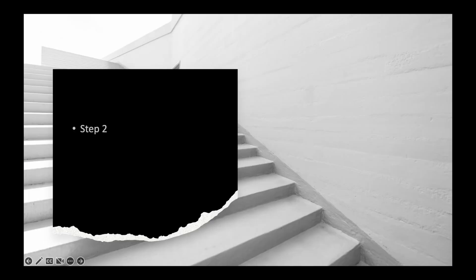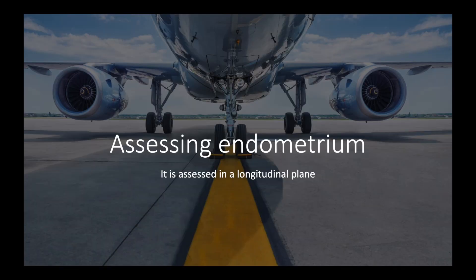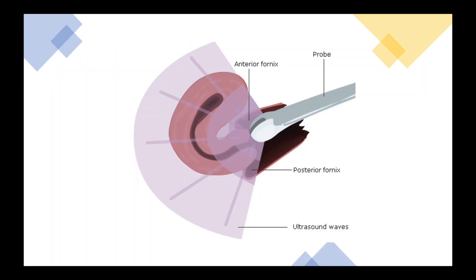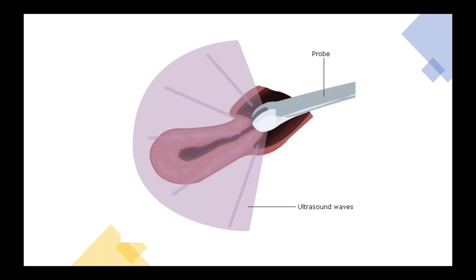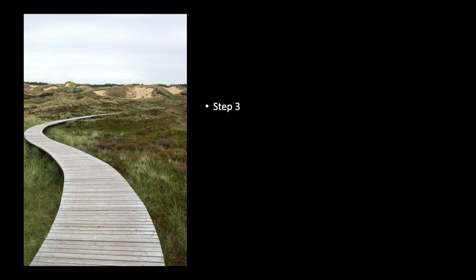Step two is to assess the endometrium in the longitudinal plane. In the case of an anteverted uterus, the probe is kept in the anterior fornix; in the posterior fornix for a retroverted uterus; and just over the cervix for an axial position of the uterus.